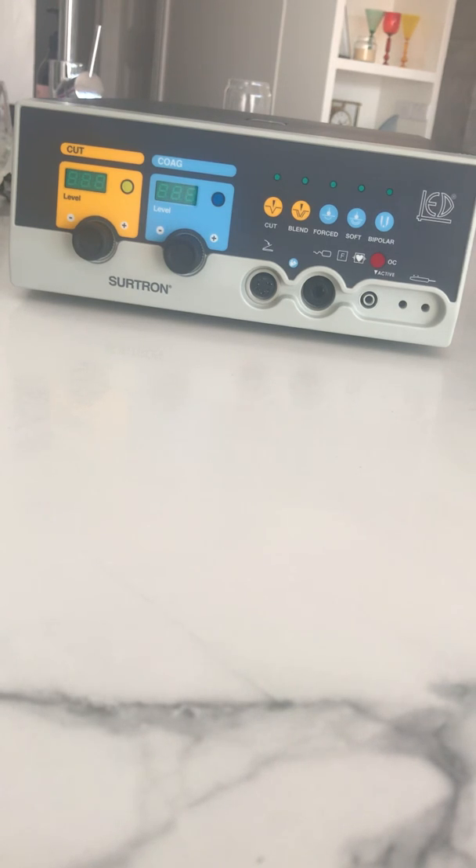Hi Paul, this is Brent Mitchell from Esteem Healthcare. I've got the diathermy in front of me now and I'm just going to run through putting together the bits so that you can see how it should be put together, just in case something was going wrong when you had it down at your place.